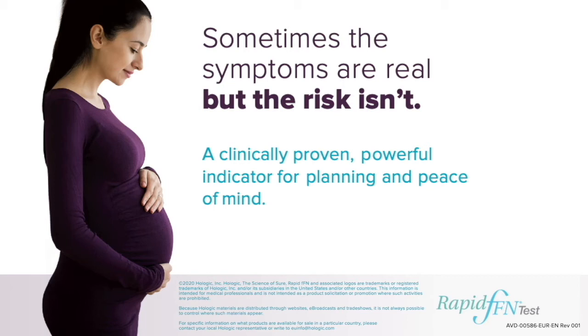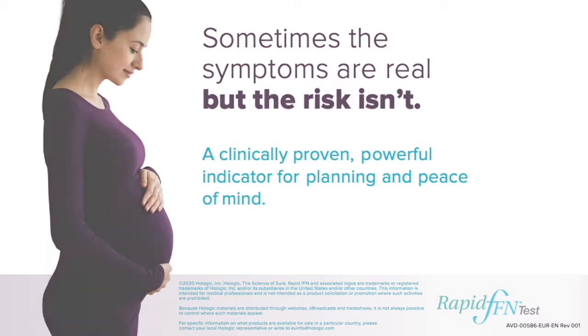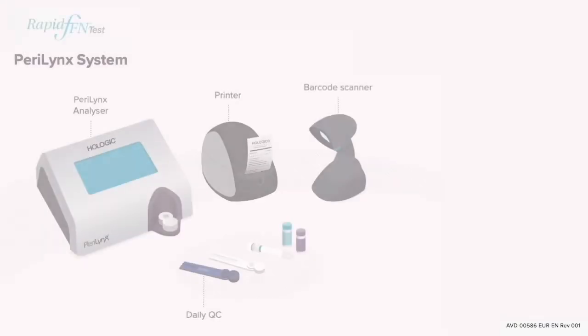Hello. Today I'm going to take you through the unboxing and installation of your Perilinx analyzer. Please watch the following setup to assist with your installation.